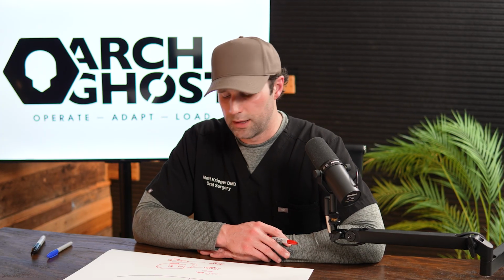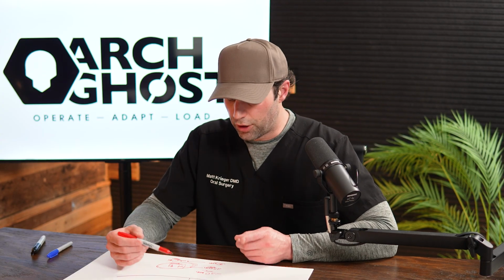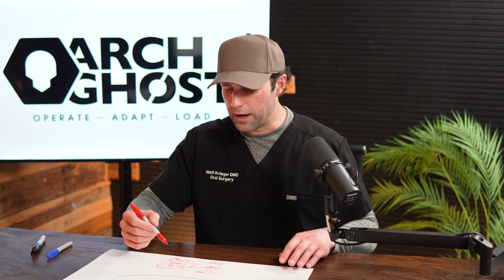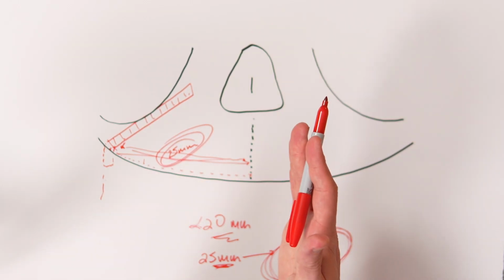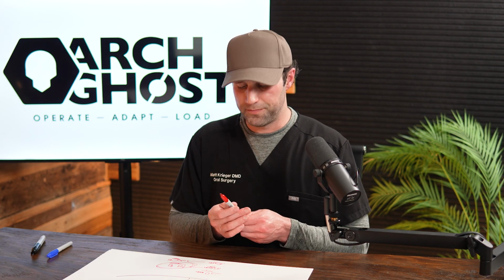A typical 4-implant configuration is normally adequate, and you know that you're going to be there from a planning standpoint. So that's a good way to look at that x-ray and tell that quickly. All right, so that's your ID point for the first one, and that's basically just that edentulous midline measurement.